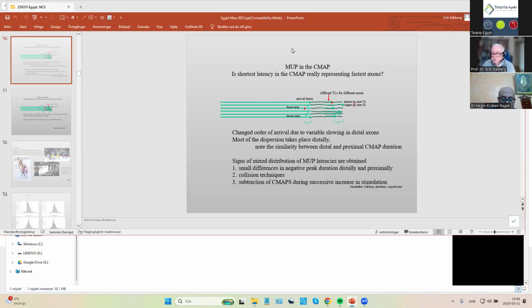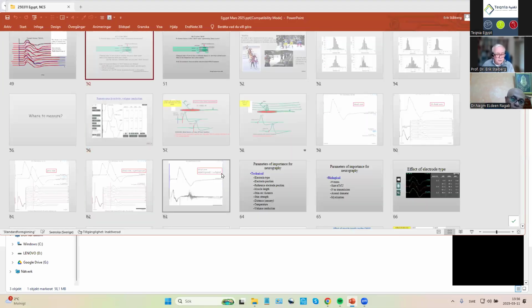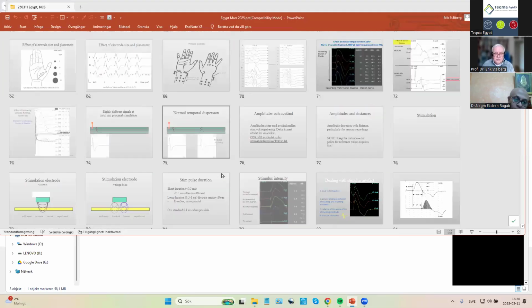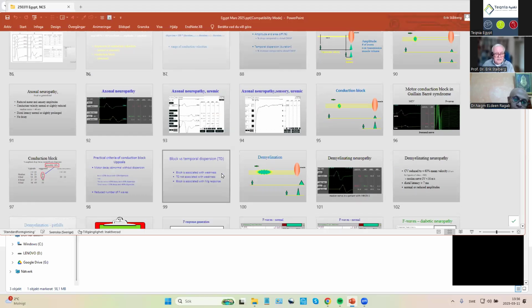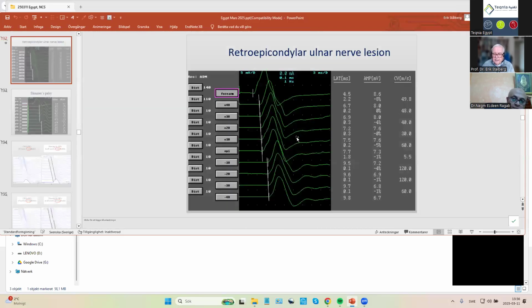So we start to come into problems, and therefore I showed you the technique of drawing a line between the signals rather than trusting only the velocities. So I say 1 centimeter is very good because it is more sensitive to detect exactly where the problem is, but it also gives some problems with velocity.